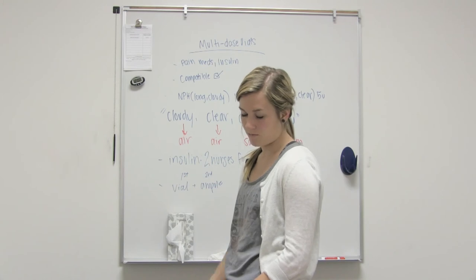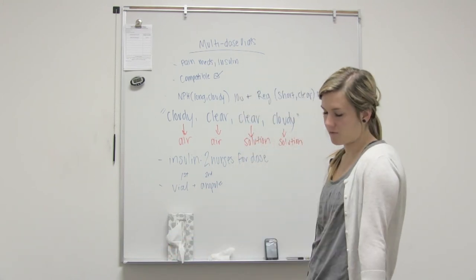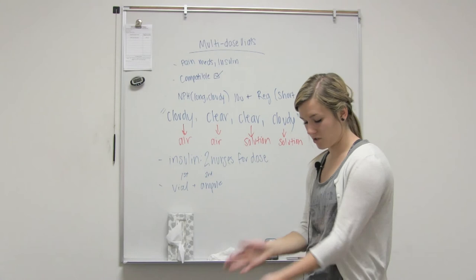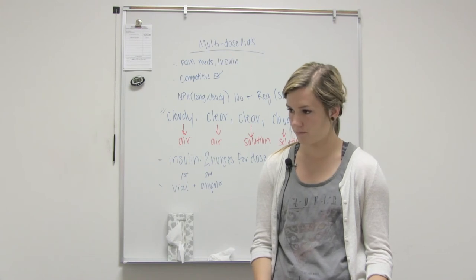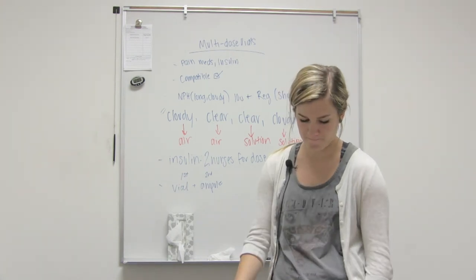Friction is important because it gets the germs off. And also it's more painful if you inject the patient while the alcohol is wet on their skin, because it stings more. So make sure it's dry, but just don't fan it, because it's going to kick microbes onto it. And don't touch it after, obviously. So you don't fan it? Yeah, I don't fan it. It's because you're going to get microbes on it.